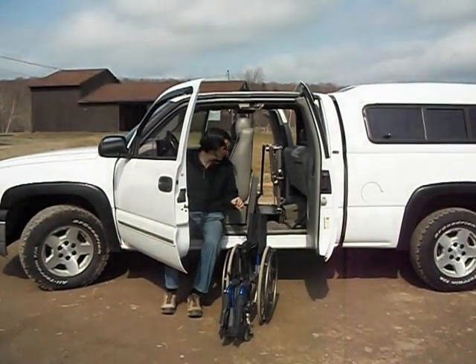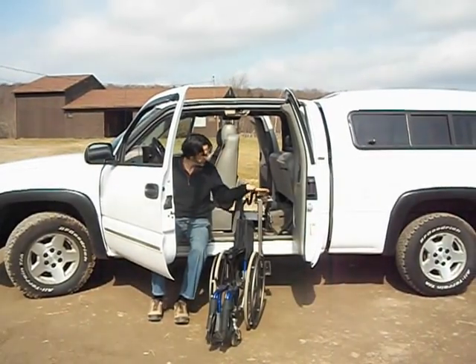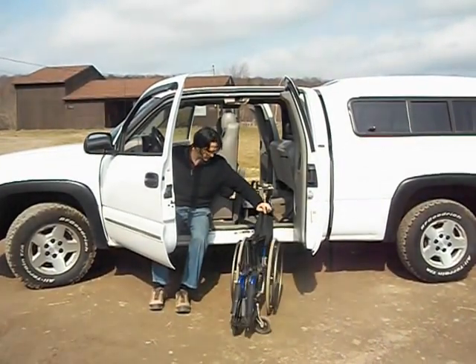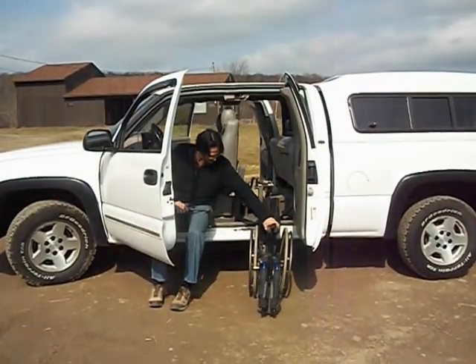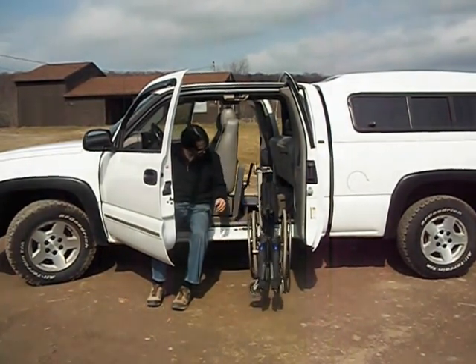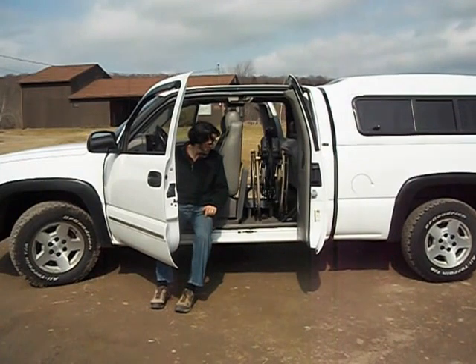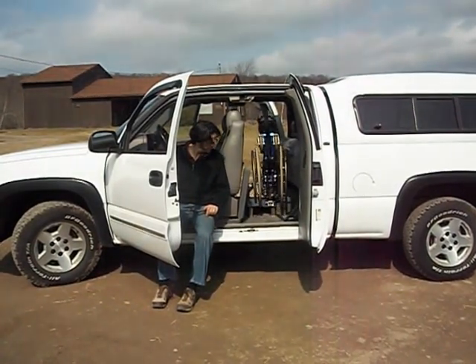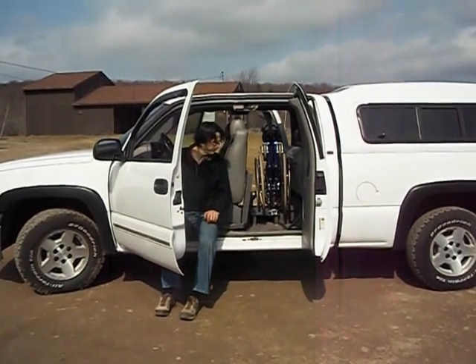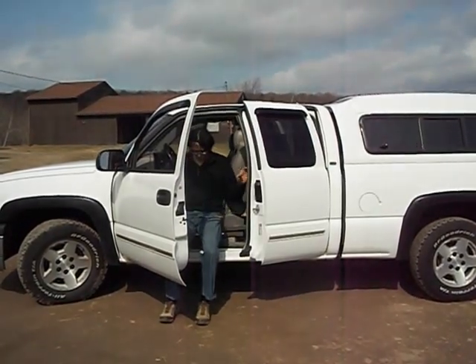Bring the EZ-STOW down. Once the EZ-STOW is fully down, you have to make sure this handle goes all the way. We line up the EZ-STOW with the pin and we're ready to stow. Once we're fully in, pull the door over.